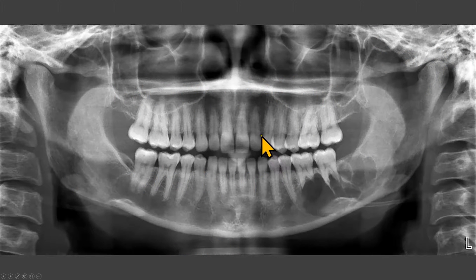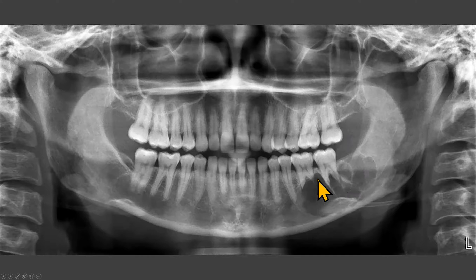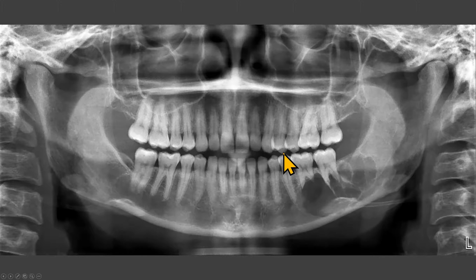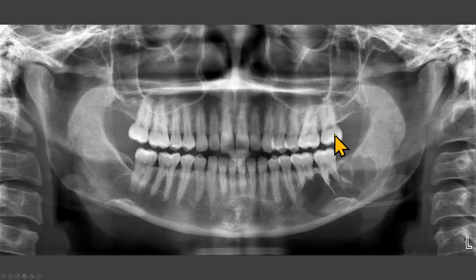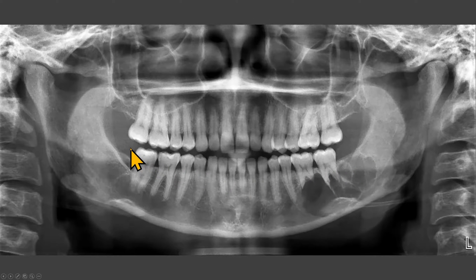Before you start interpreting a panoramic radiograph, evaluate if the patient positioning is correct. Then review all the teeth. I know you will be tempted to look at the striking finding in the mandibular left posterior region. Still, I recommend that you follow the standard protocol. My protocol is to start from the area of number 1 going to number 16, and then 17 to the area of 32. After that, I'll come back to the area of this lesion.